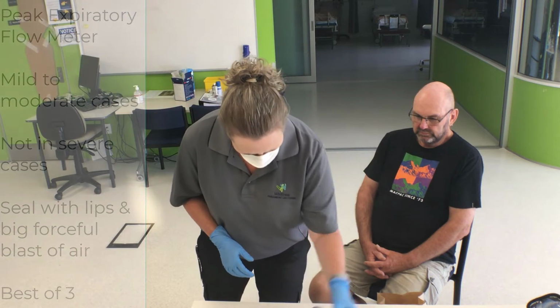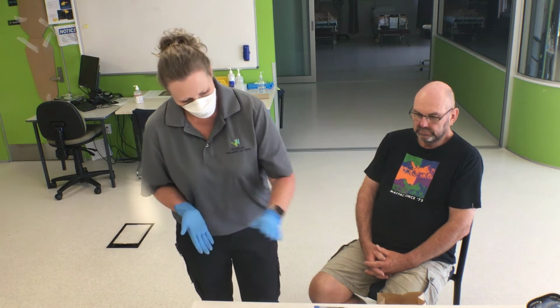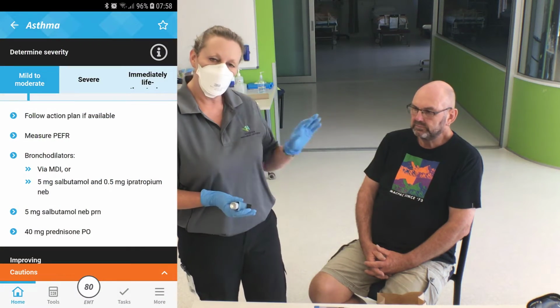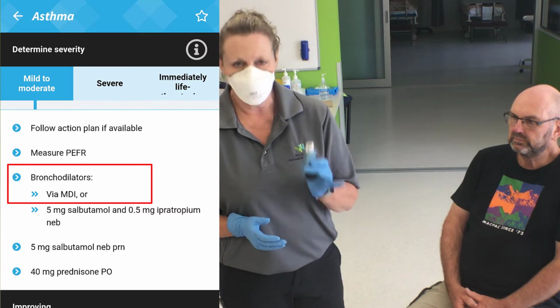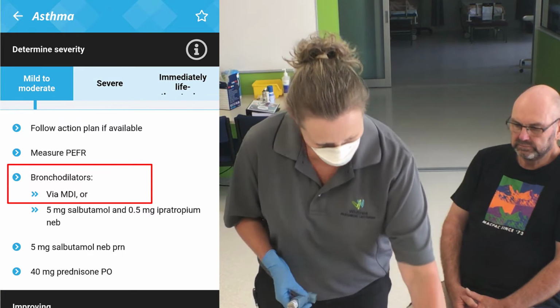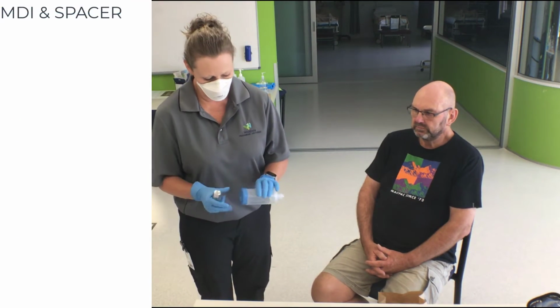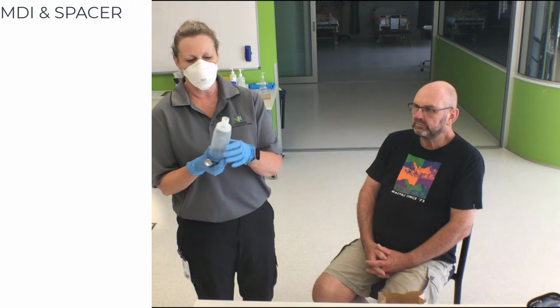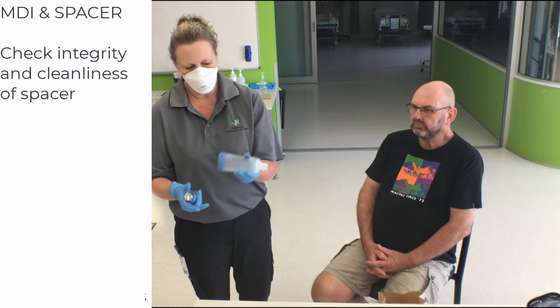The next thing we're going to do is administer salbutamol, either using the patient's own if it's not expired, or the ambulance MDI. So there's a way to do this, and it is going to take a bit of time, and we just need to talk our patient through this. So we're checking that this is clear, and whilst this chamber might not look clear, it's actually a shaded plastic.